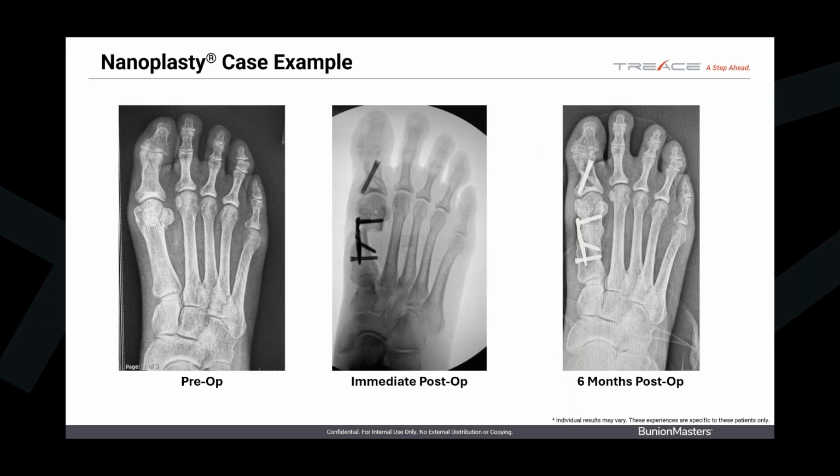You want to protect them. So you'll see 6, 9 months, 12 months later, depending on when you see your post-op, you'll see that whole triangle of lack of bone at that lateral cortex filled in and the ray being rectus. So it will happen to you.